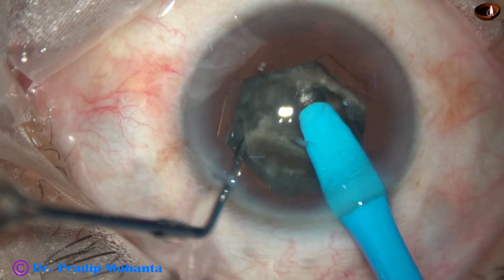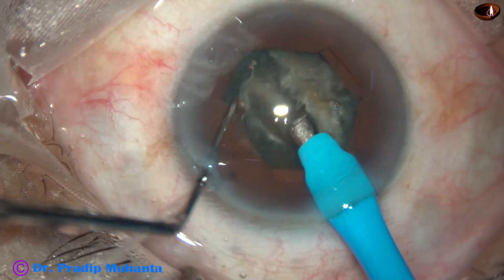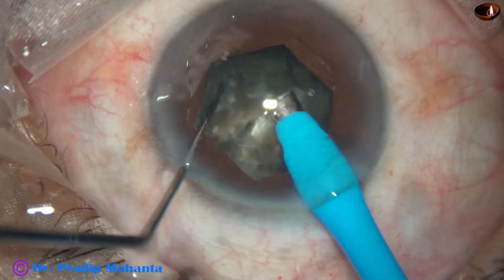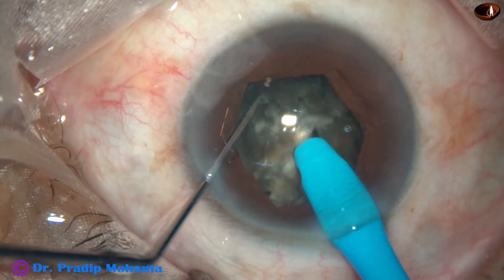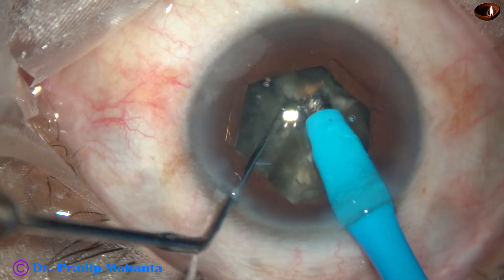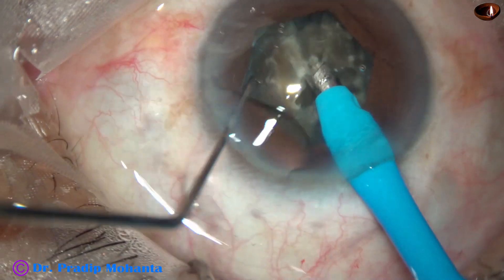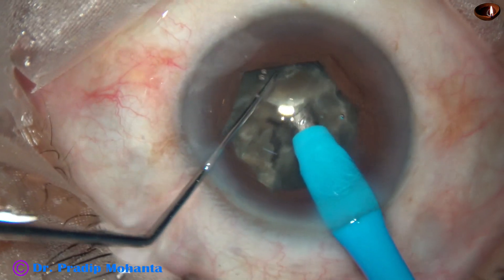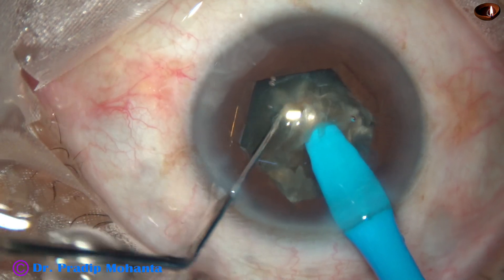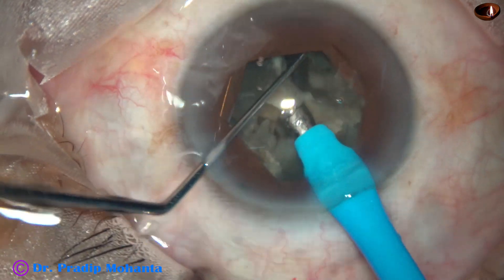I do not do a lot of lateral separation. I just come to the other side, rotate the nucleus 180 degrees, and along the initial crack, separate the nucleus into two heminuclei. Each heminucleus is then subdivided into two pieces — the phaco tip goes through the heminucleus, stops at some point, and it is chopped into fragments.